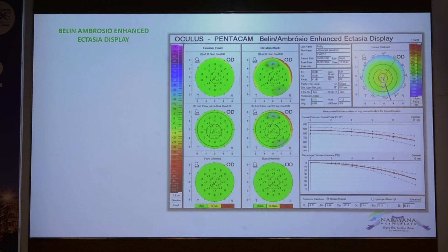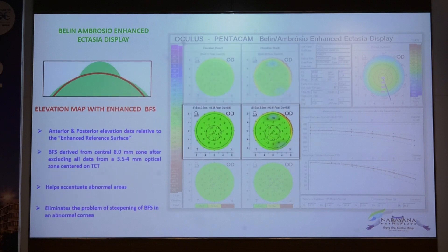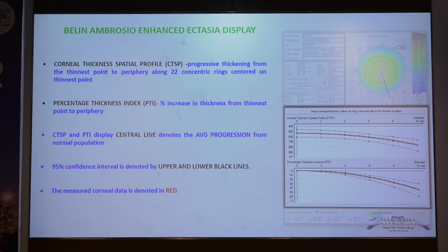This is the Belin Ambrosio Enhanced Ectasia display. It shows the elevation map with standard BFS calculated over a fixed optical zone of 8 mm, then the elevation map with enhanced BFS, wherein we exclude the data from 3.5 to 4 mm centered around the TCT, which helps to accentuate abnormal areas. This is the difference map. The CTSP, or corneal thickness spatial profile, gives the progressive thickening from the thinnest point to the periphery along 22 concentric circles. We have the PTI, which is percentage increase in thickness from the thinnest point to the periphery, and it should be within the central line or the upper and lower black lines, which indicate 95% confidence limits.